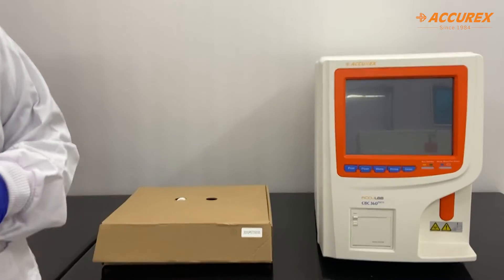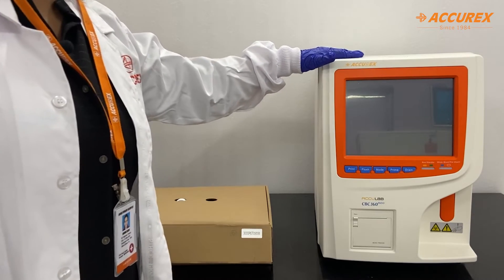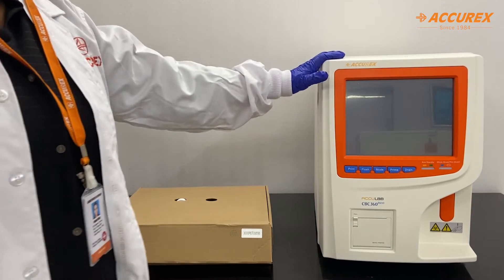Hello everyone, greetings of the day. Today I am going to show you our Accurex 3-part analyzer which is the CBC360 Neo RFID, the cell counter.